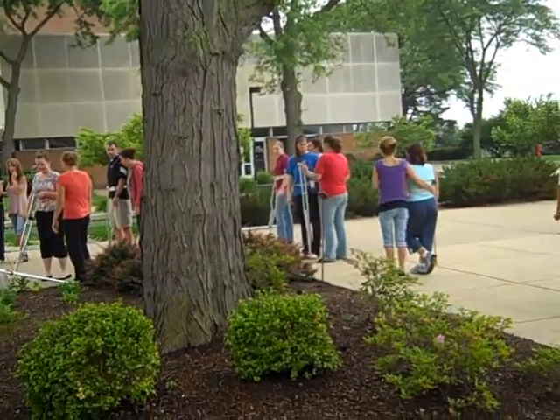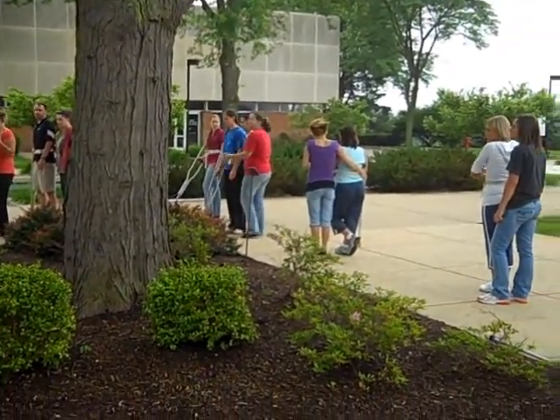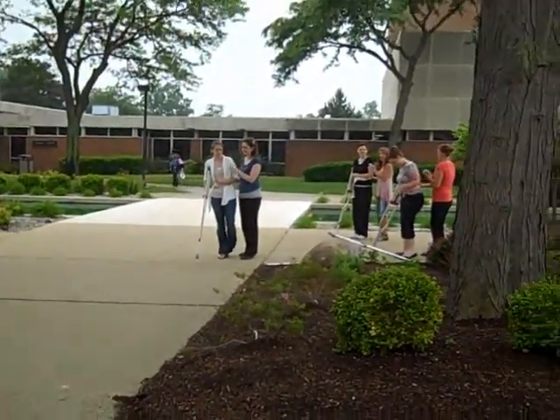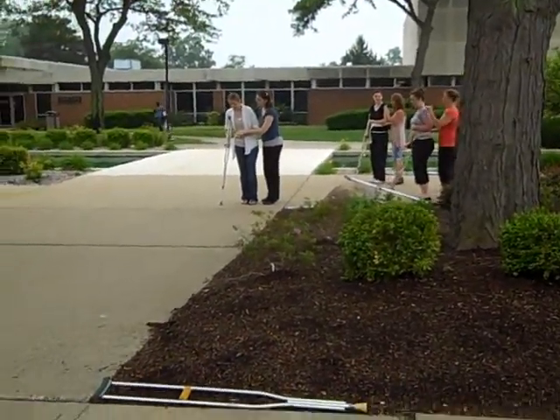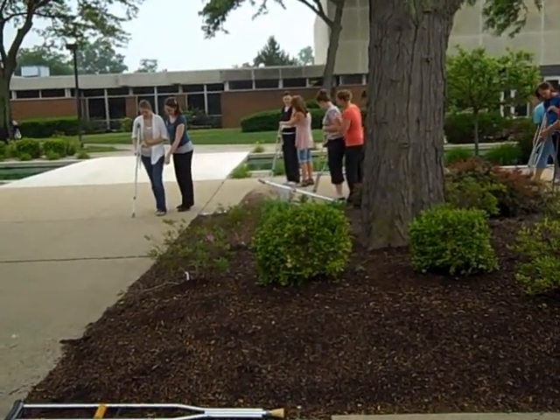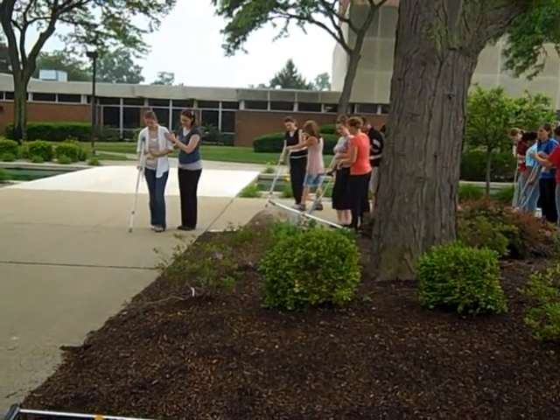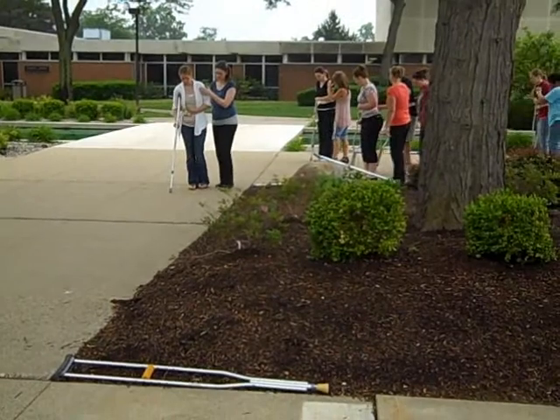Modified point gait. We're going to assume that their left upper extremity doesn't work at all — picture it in a sling. Go ahead and teach the modified point gait. Left side involved. Left side involved? Yes, right-side CVA would be left-side hemiplegia, correct.